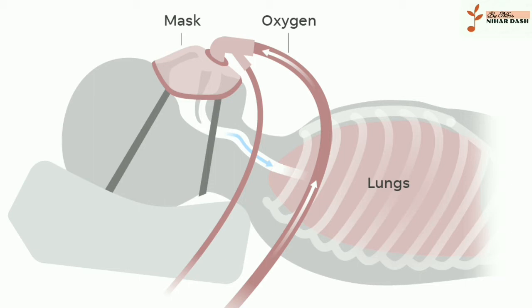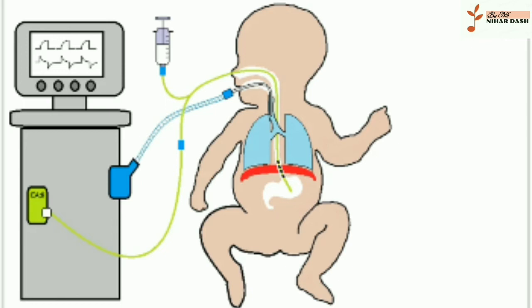Ventilator Bird 2, the Bird VIP infant. Ventilators are sometimes called respirators, a term commonly used for them in the 1950s, particularly the Bird respirator. However, contemporary hospital and medical terminology uses the word respirator to refer to a protective face mask.